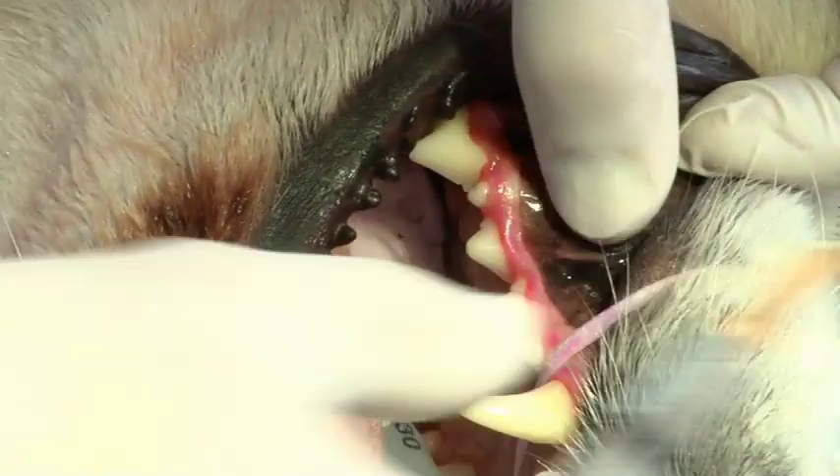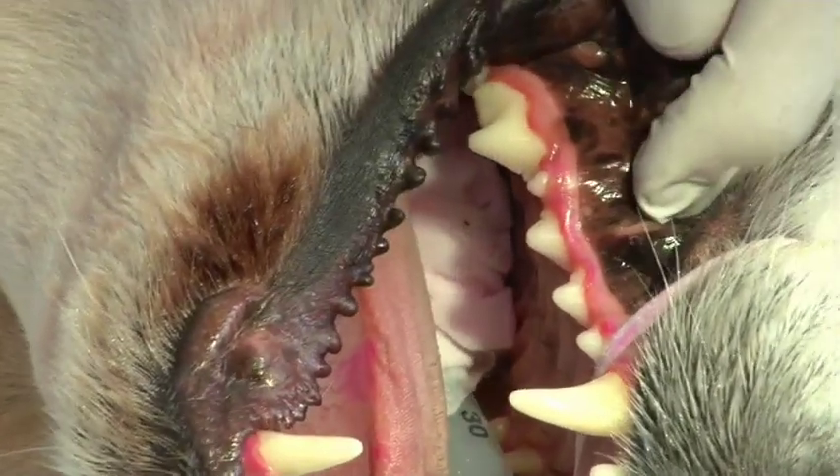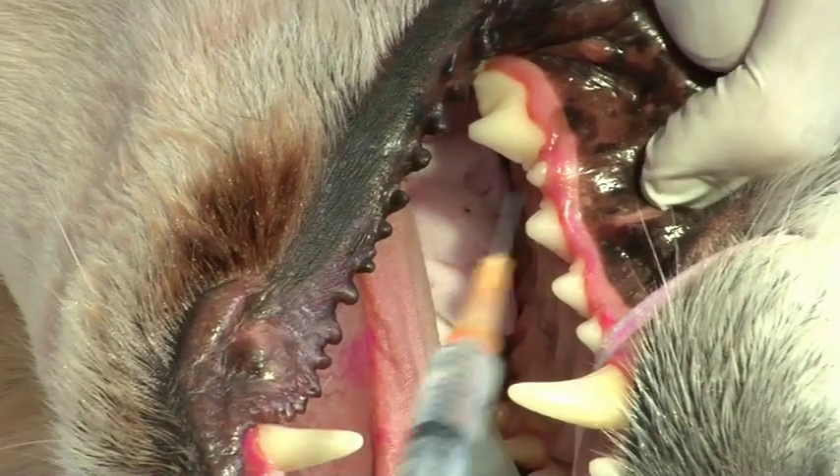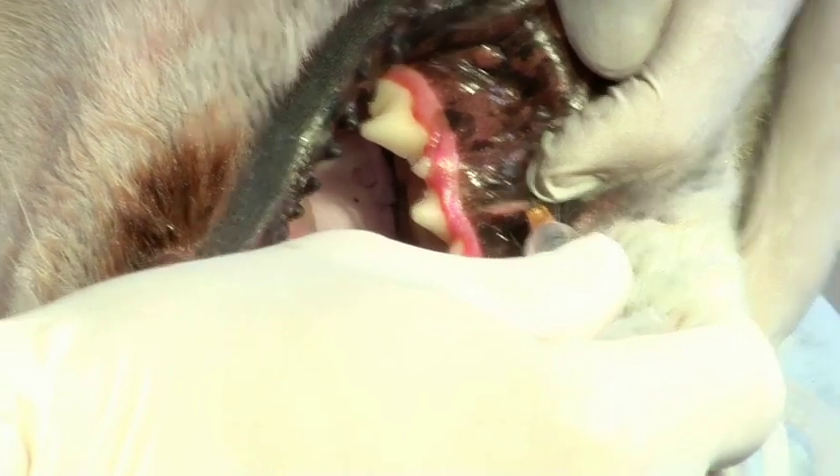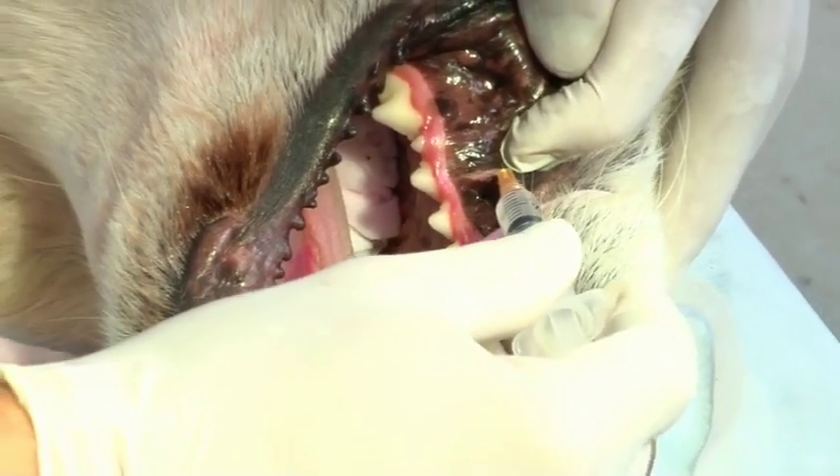To extract the upper premolar tooth, we will give an infraorbital block. This will block the infraorbital nerve, giving anesthesia to the premolar teeth, canines, and incisors on that side of the mouth.